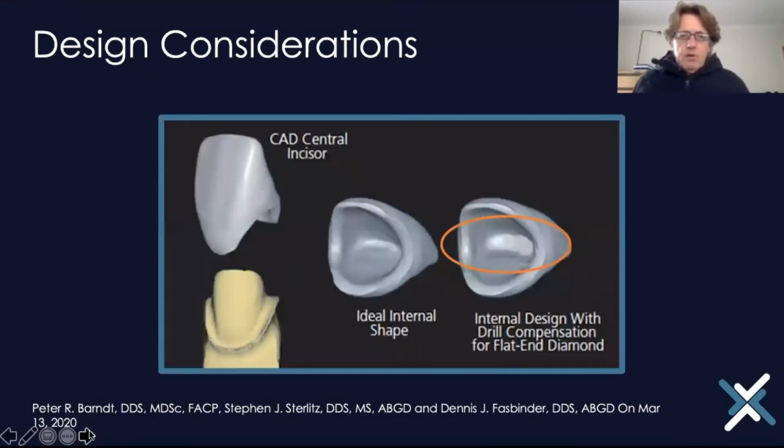So let's have a look at a crown now. So now we get down to the prep. This is what you came in for. If you look on the left-hand side, I don't know if you can see the mouse, on the prep itself there, you can understand that the crown, needless to say, has to fit on there, and your margin is around, and you can see the margin that is milled out.